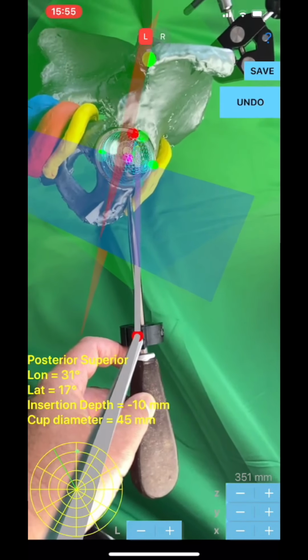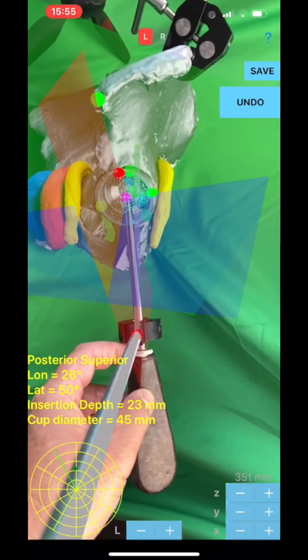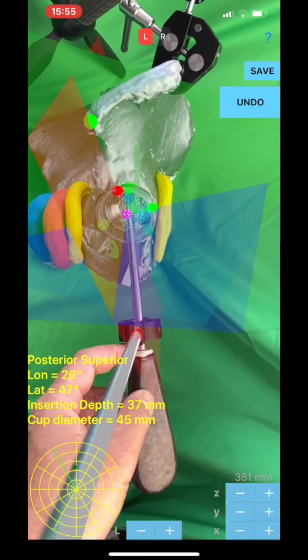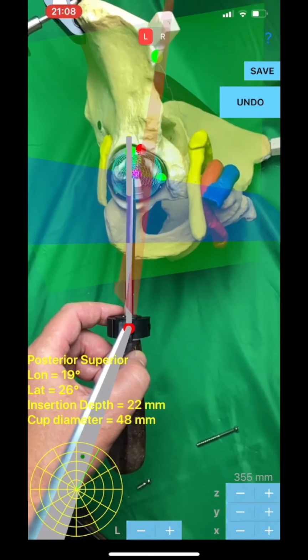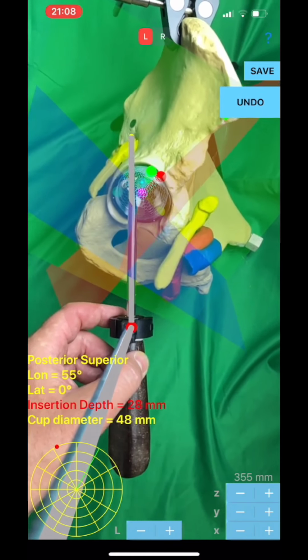in 3D projection inside smaller semicircular subdivision areas of the quadrants of the cup. The color of the dot changes continuously according to the depth of maximum bone purchase allowed in mm, while the tip of the screw is inserted in the corresponding semicircular subdivision areas of the quadrants of the reflected topographical map, with already known values from the international literature.